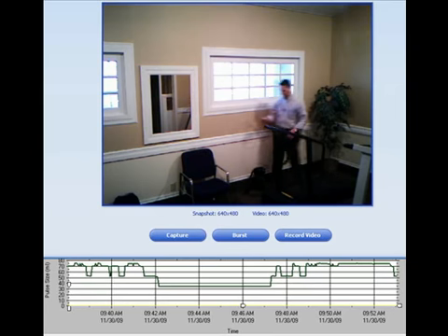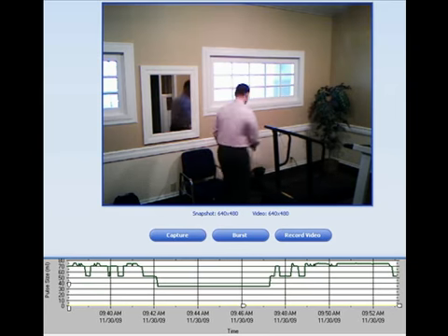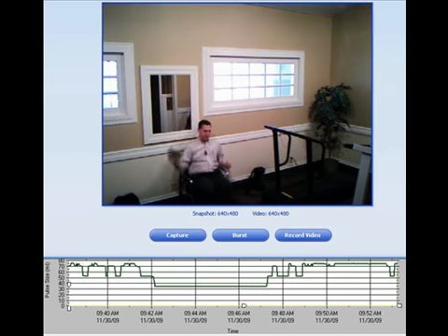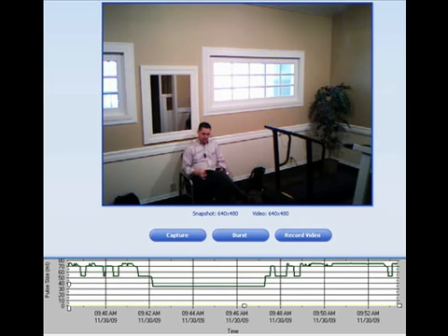Once again, the dose has remained higher as exertion has continued. As Rich gets off the treadmill and sits down, the dose will again come back down to baseline automatically. SmartDose increases the dose at activity and decreases the dose at rest. And as you can see, the unit is very responsive and very consistent.